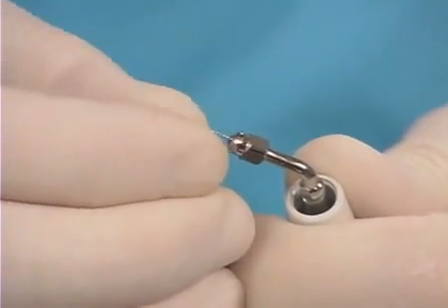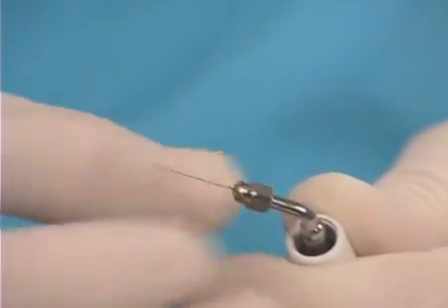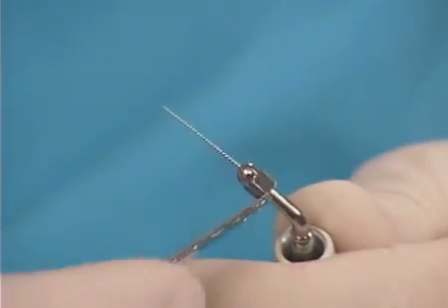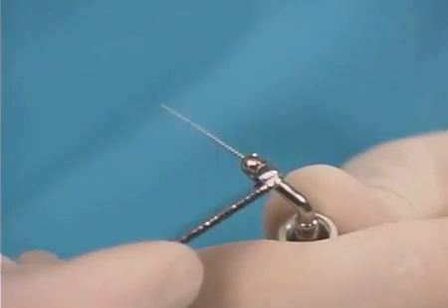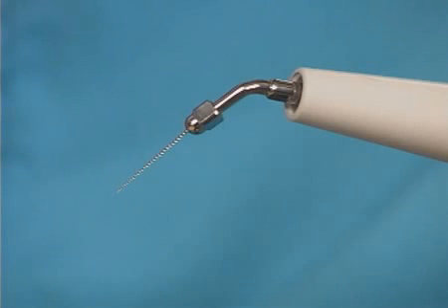We've seen the ultrasonic file adapter earlier in the show. This device can also be utilized when managing perforations, importantly perforations occurring apical to canal curvature. Once MTA is delivered to the target zone, a pre-curved file inserted into the file adapter can be utilized to gently vibrate MTA into a root defect.